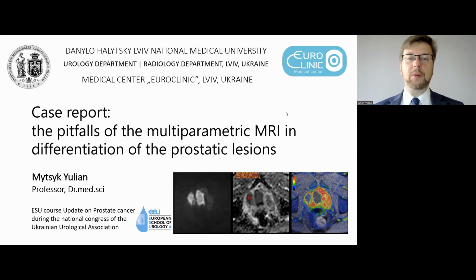My case comes from the Lviv National Medical University, Departments of Urology and Radiology, and Medical Center Euroclinic, Lviv, Ukraine. This case is dedicated to the pitfalls of multiparametric MRI in differentiation of prostatic lesions.